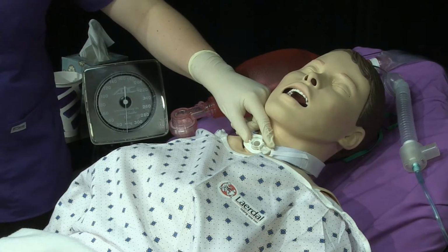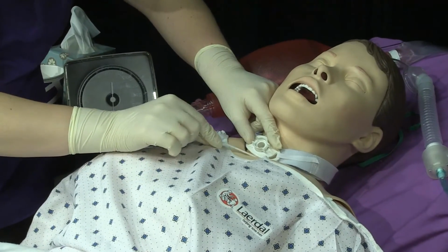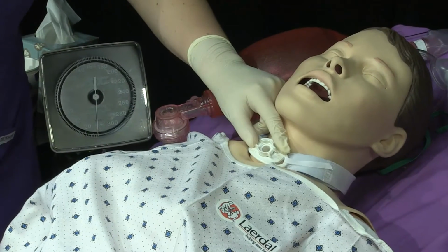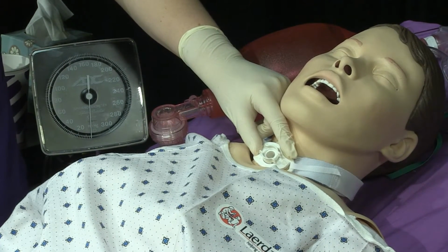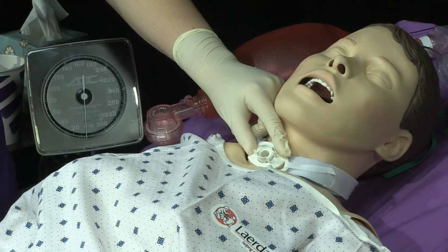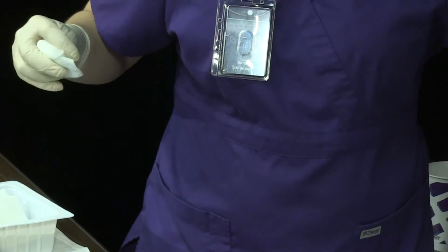Gently cleanse outer area of tracheostomy. Cleanse from the stoma outward. Pat outer area of tracheostomy dry with sterile gauze.